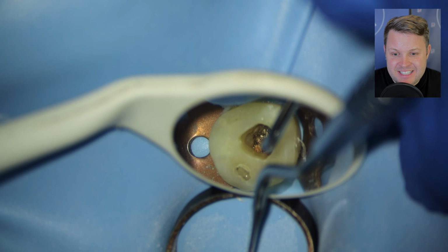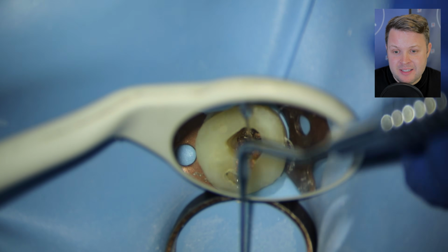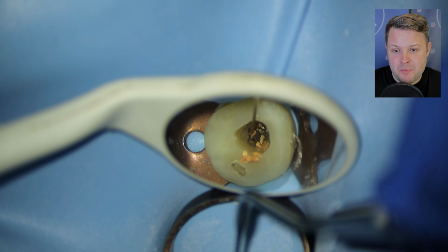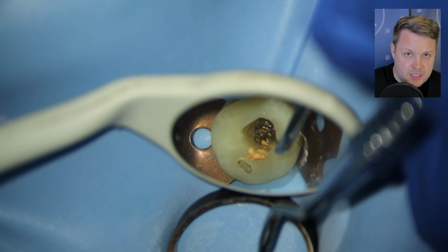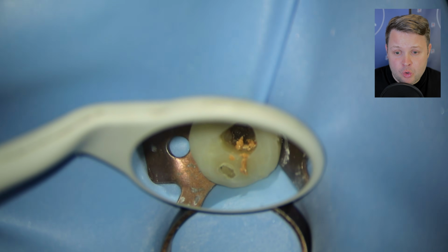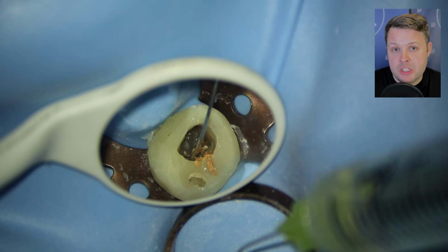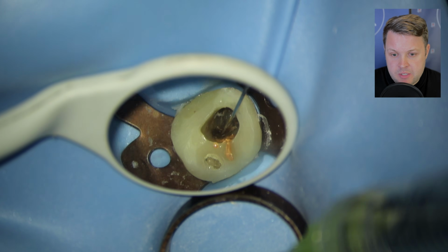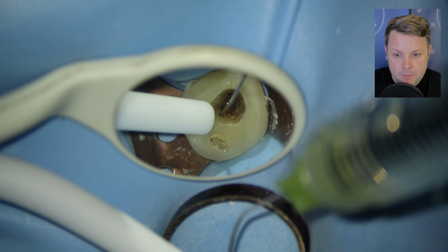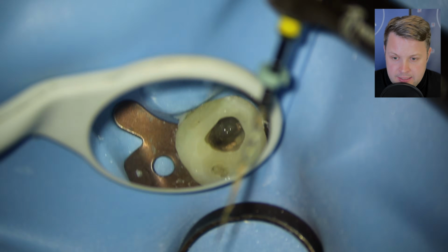In this case, the root canal is quite old, and the problem is when you whiz a rotary file down there, it can break things up. So it's a bit of a cross between getting the GP out quicker if you can, or pulling it out in one. I would say, especially if I'm doing centrals, I want to try and pull the GP out in one, and I'm going to use lots and lots of irrigants. What I've noticed here is the GP isn't being removed in one piece, and as I pick away at it, it's breaking up into little tiny pieces.